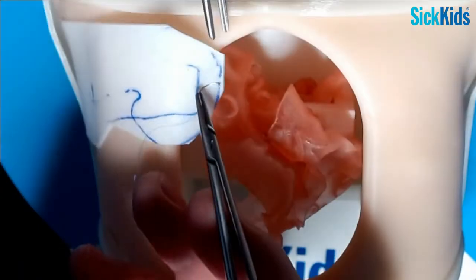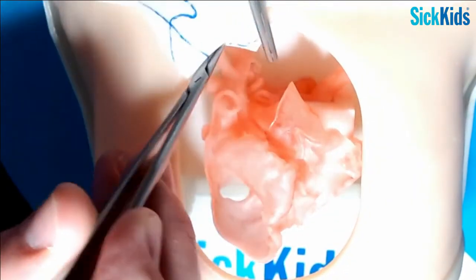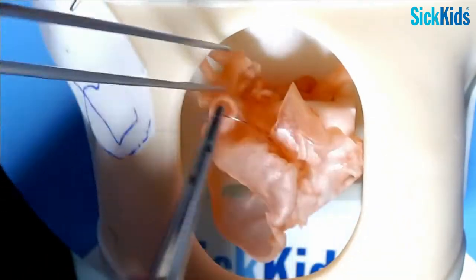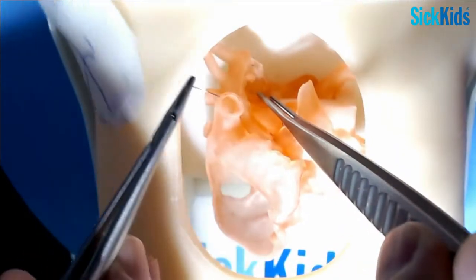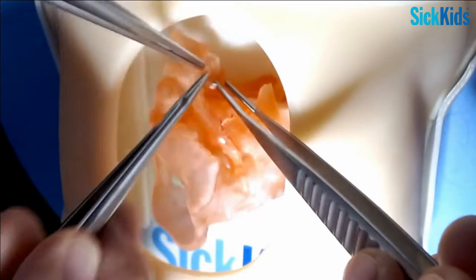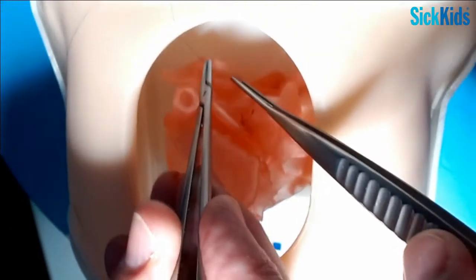Okay, so typically start just adjacent to the toe, to the right of the toe down here. Can we rotate it this way a little bit? Towards you. Yeah. Perfect. So what we do in real life, need a little more light in there.